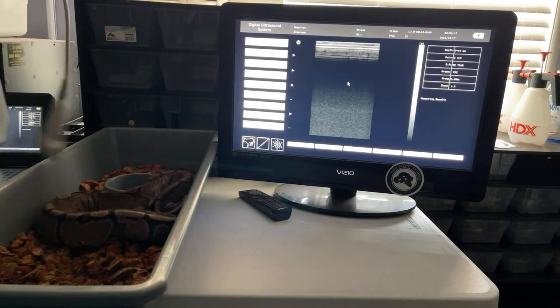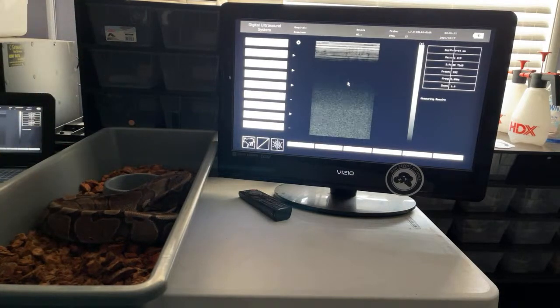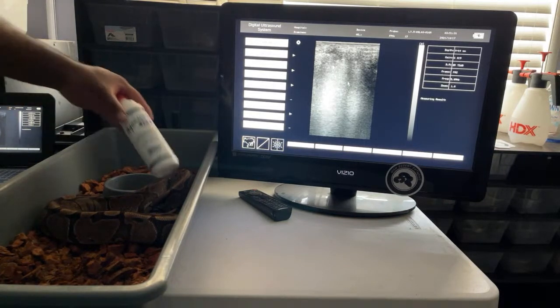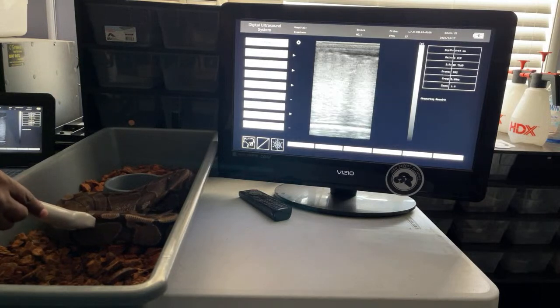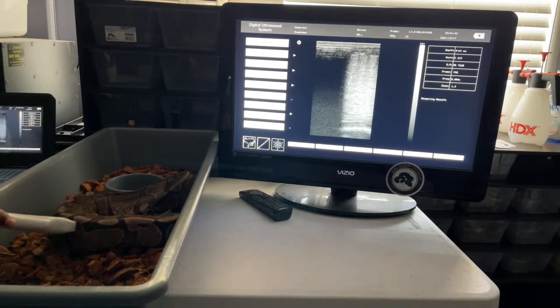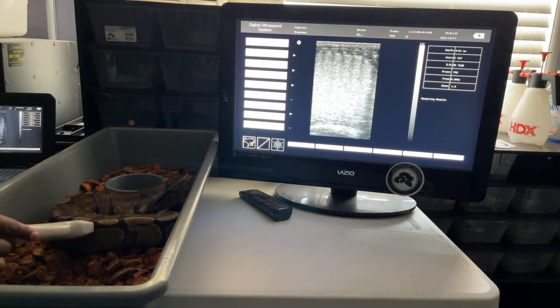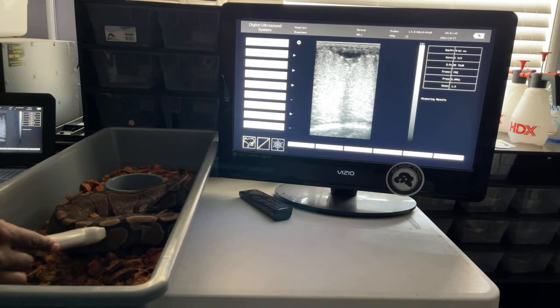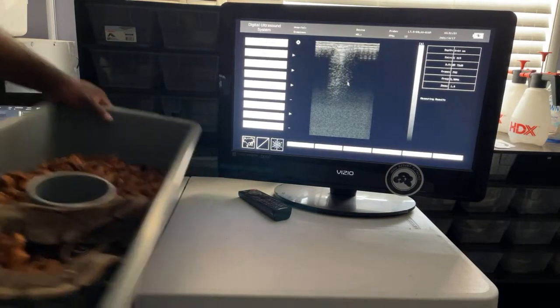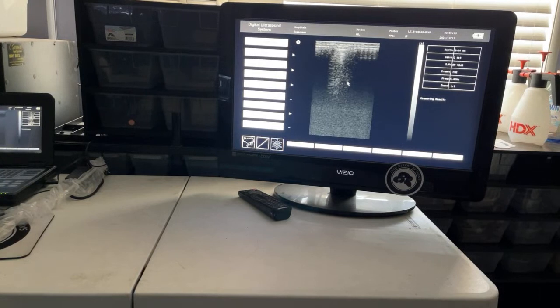Calm your ass down. Elliot, move. Yeah, I know. We're gonna make this quick and painless. Whoa, splash right on my face. Pause. Chill out. Boom, see that? That's a whole ass egg there. That's why it's so white. So that's what one that's about to lay should look like on an ultrasound. See the curve? That's two eggs next to each other. And that's enough for her. She is a wrap. Y'all not getting me bit on camera live, so I can be like, oh! Hell no. She is not my friend.